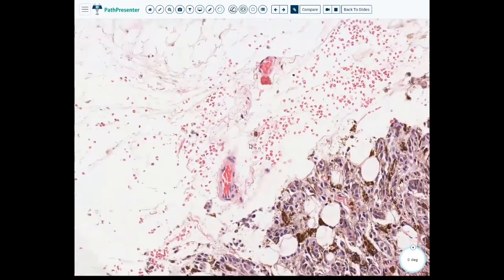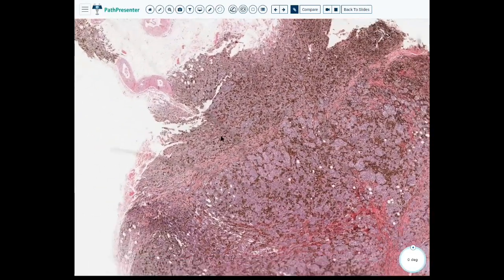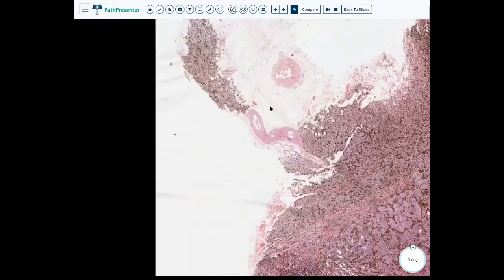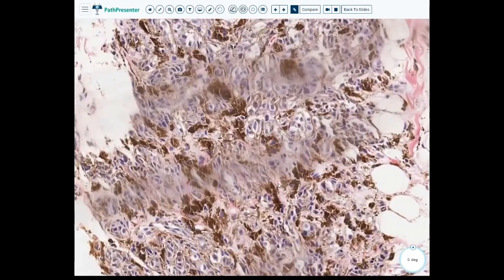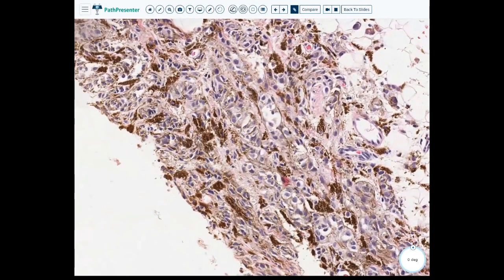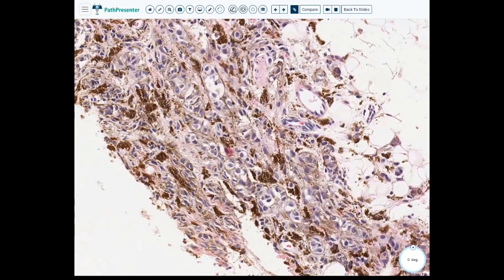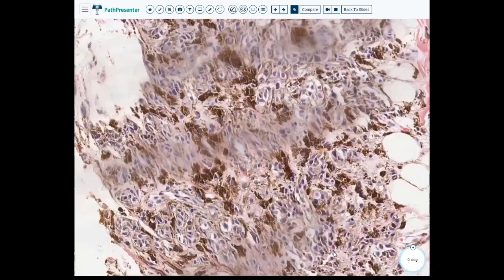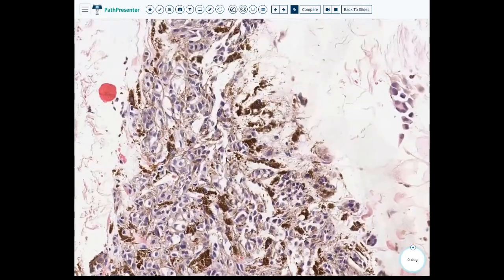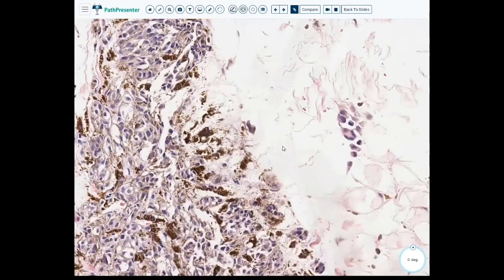And okay, so we're now at like the deep aspect of the dermal portion. Remember, our epidermis is over here, and I'm not getting a sense that this is really maturing. It kind of just looks like the same stuff all the way through. Maybe these, those are like lymphatics. They're very plump, they're irregular. These are scary looking cells, but it has this background semblance of blue nevus.